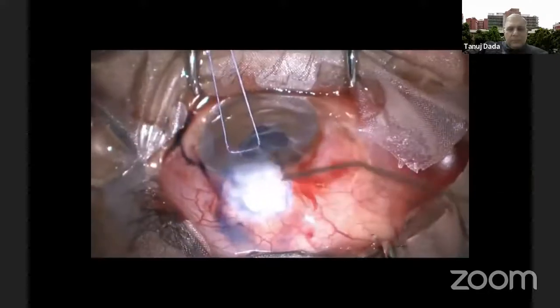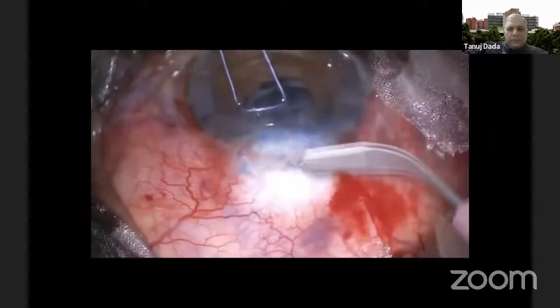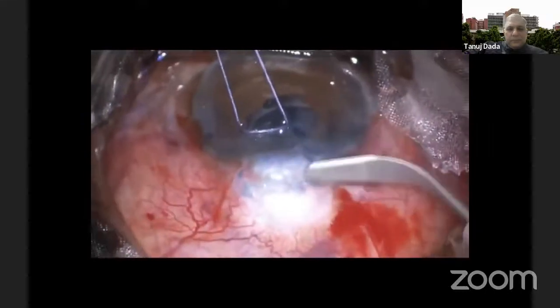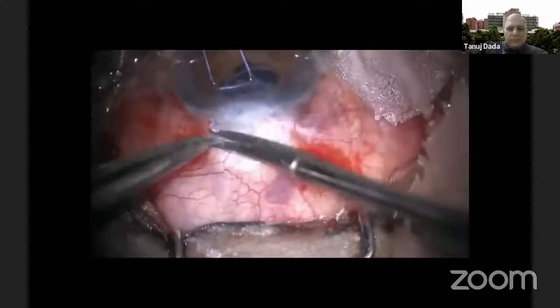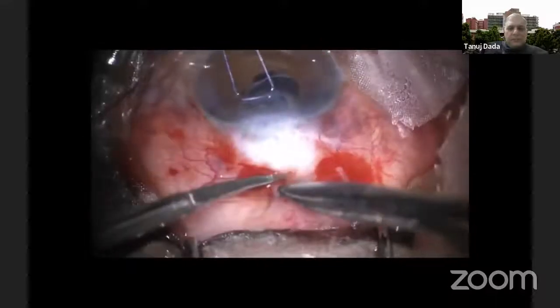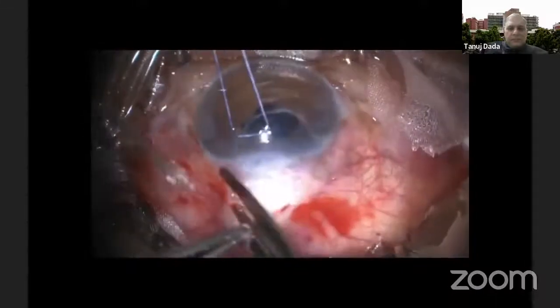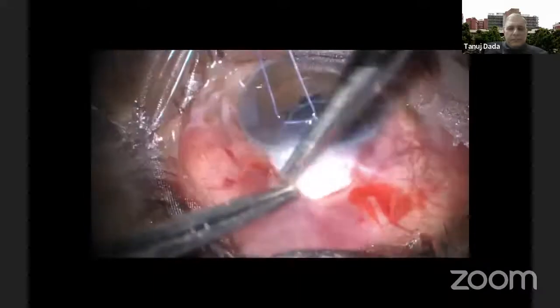The conjunctiva over the thin avascular bleb was stained using trypan blue dye, and the epithelium is scraped off using a Weck-Cel sponge. The thin necrotic conjunctiva is removed, and the surrounding conjunctiva is undermined to create a conjunctival Tenon flap behind the avascular bleb.